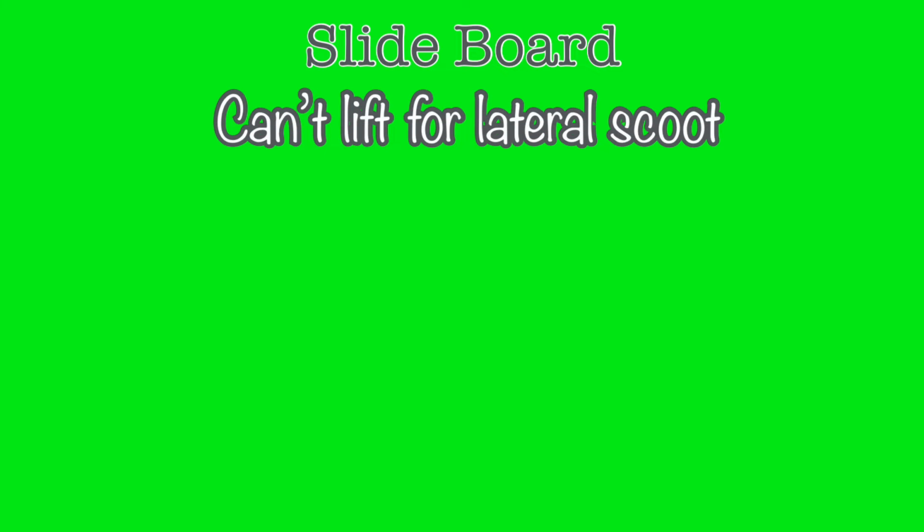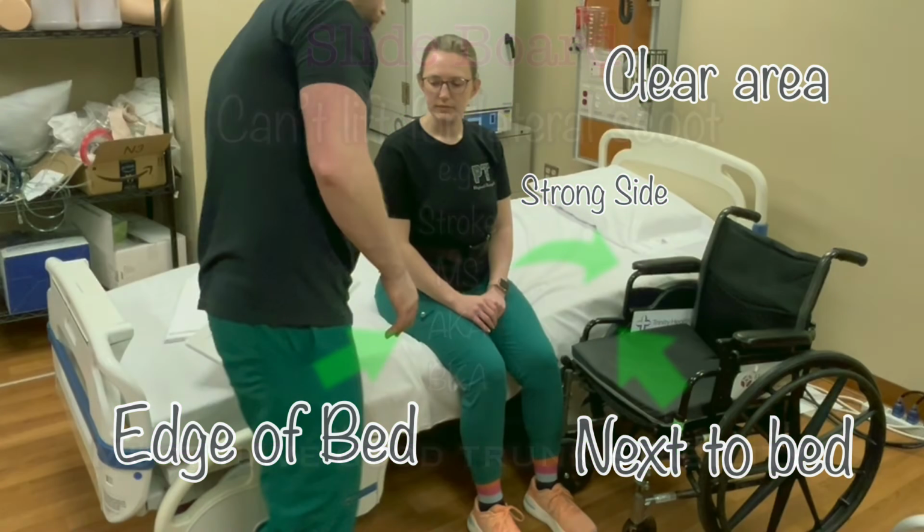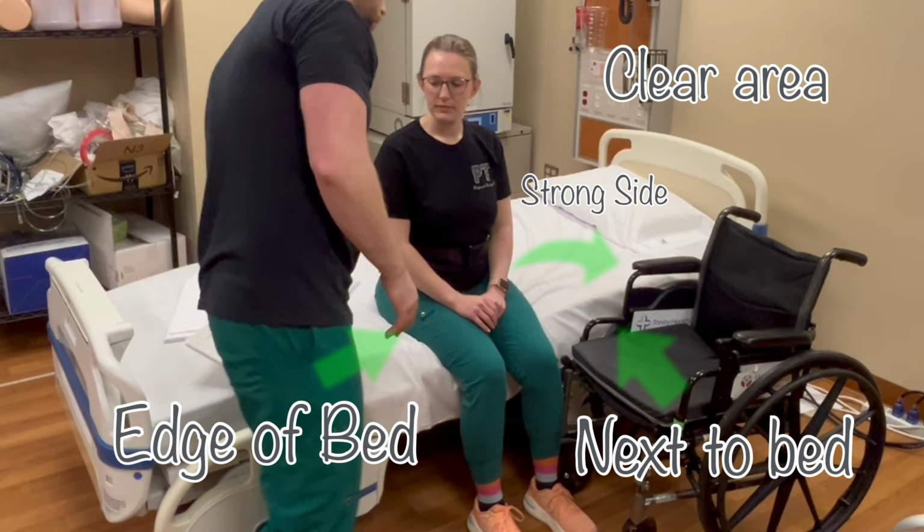Similar to a lateral scoot transfer, you may find need to utilize a slide board to transfer between bed and chair. Generally, a slide board is needed when the patient is not able to lift up enough to perform a lateral scoot. The slide board allows them to perform the movement without needing to lift as much. This can be useful in strokes early on, and MS, and they are used regularly with above and below knee amputations. In all of these examples, the one thing you need to ensure before using a slide board is that the patient has good trunk stability while sitting. If they are not able to maintain a seated position at all, this is not a safe transfer technique for this patient. Set up the environment and position the patient the same as you do for a lateral scoot.